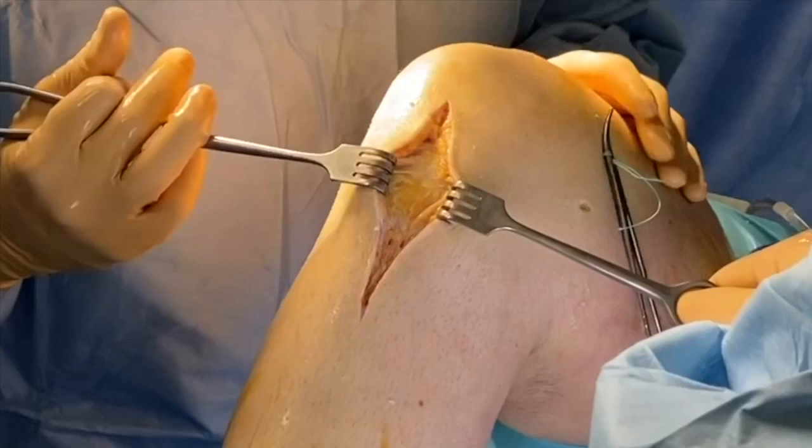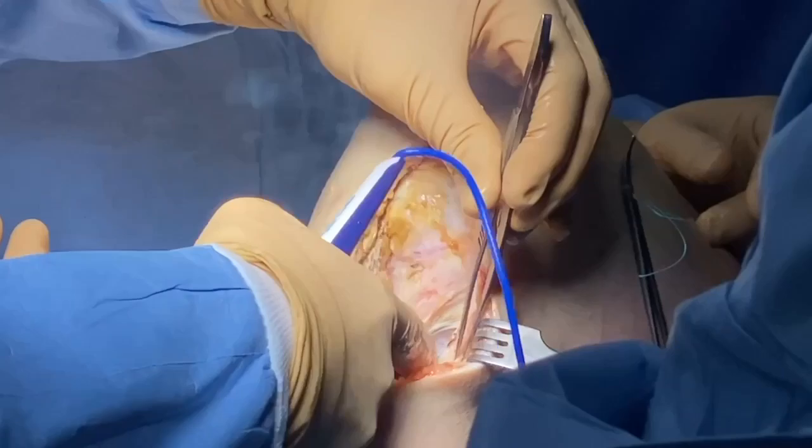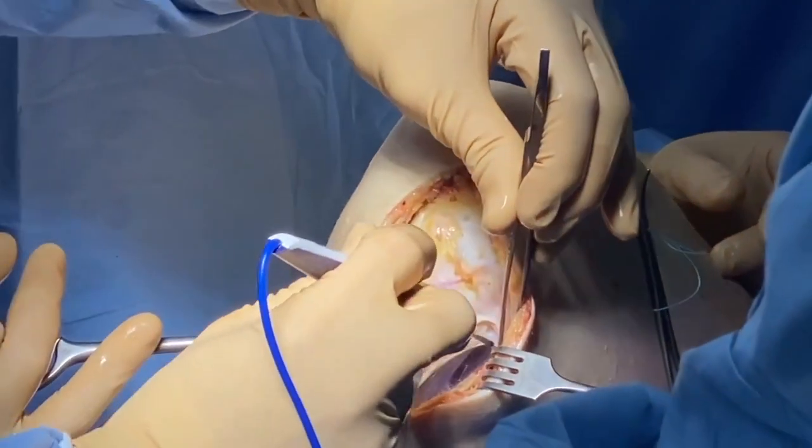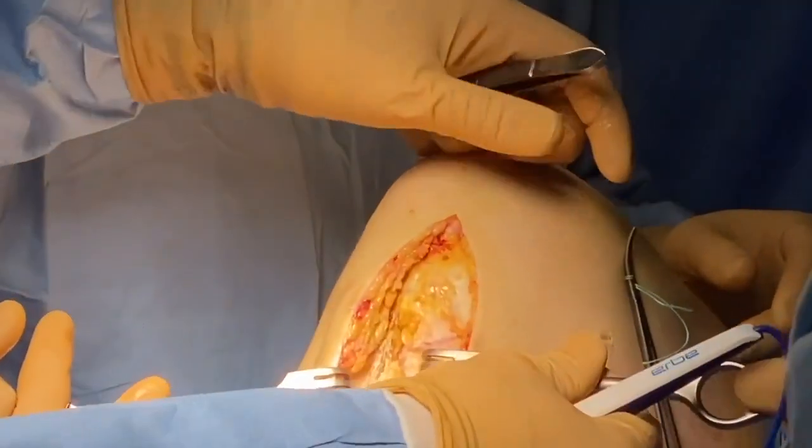It's a standard medial approach. We include in this approach the hamstring harvesting of the previous surgery. We dissect the deep fascia and the pes anserinus to assess the MCL completely.